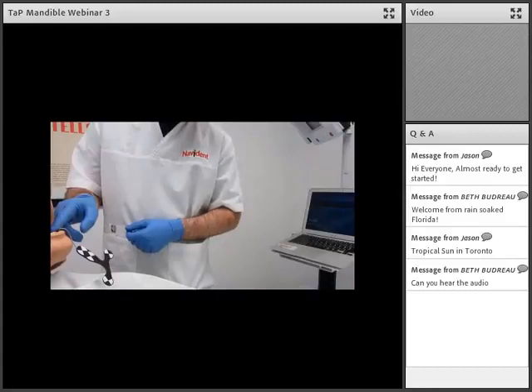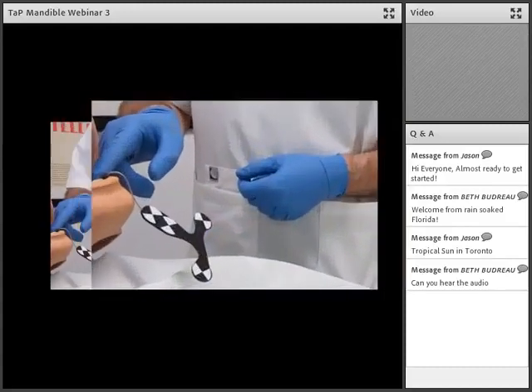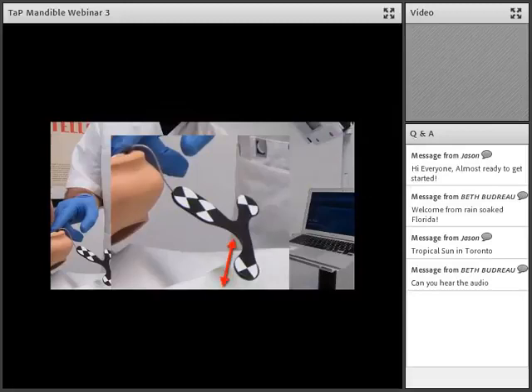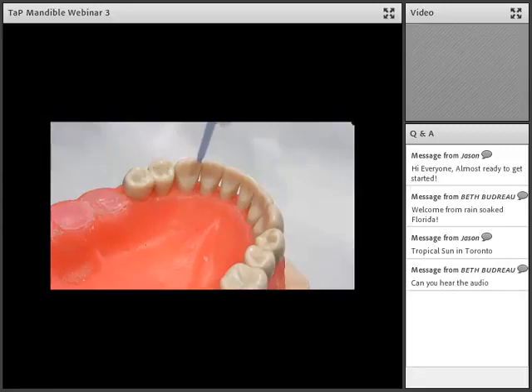I can now connect the wire to the tooth or teeth. I start with applying a thin continuous layer of material onto the lingual and incisal surfaces of the selected anchoring incisor. It can be convenient to use 2 teeth crowns and to place the wire just over the embrasure area.